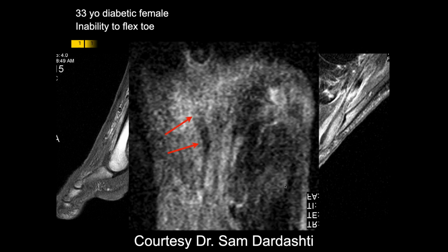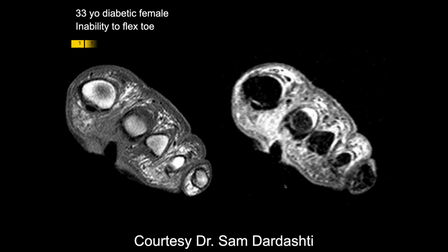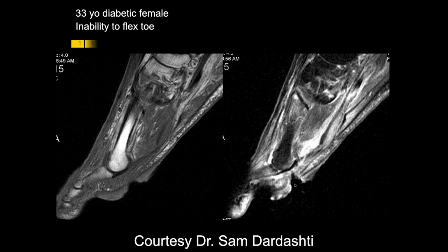I'm not quite sure what we're looking at here. What is that hole in the base of the foot? I think it's an ulcer, a soft tissue ulcer. Thank you. I kind of figured that.